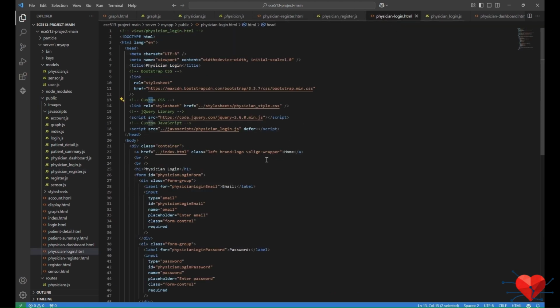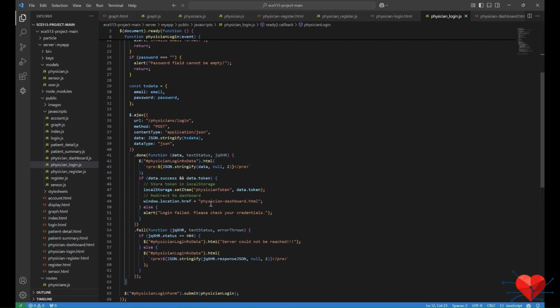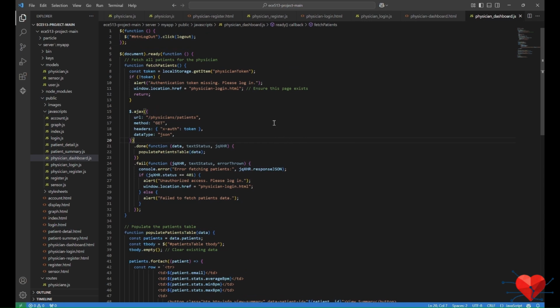Similarly, the login form managed by PhysicianLogin.js authenticates physicians by sending their credentials to the backend. Upon successful authentication, a JWT token is generated and stored in local storage, enabling secure access to their dashboard. Once logged in, physicians access the physician dashboard, where physicianDashboard.js fetches all their assigned patients using Ajax. The dashboard displays their patients' heart health effectively.